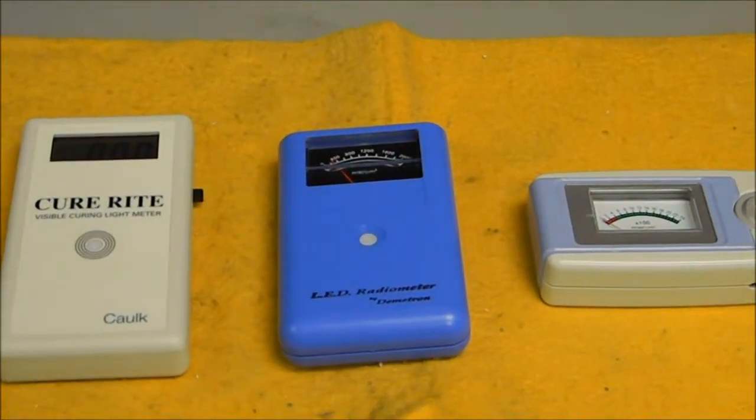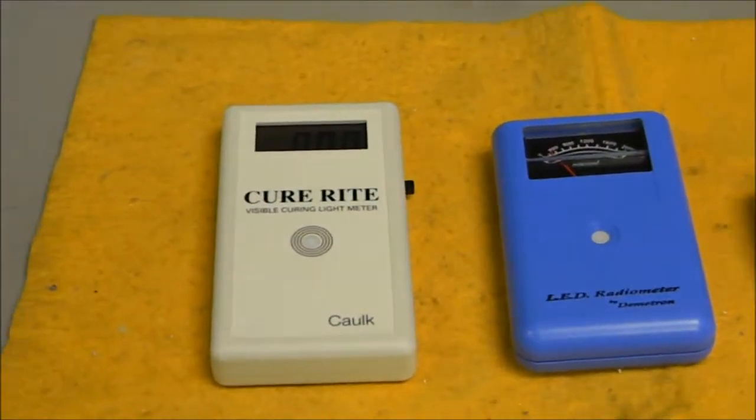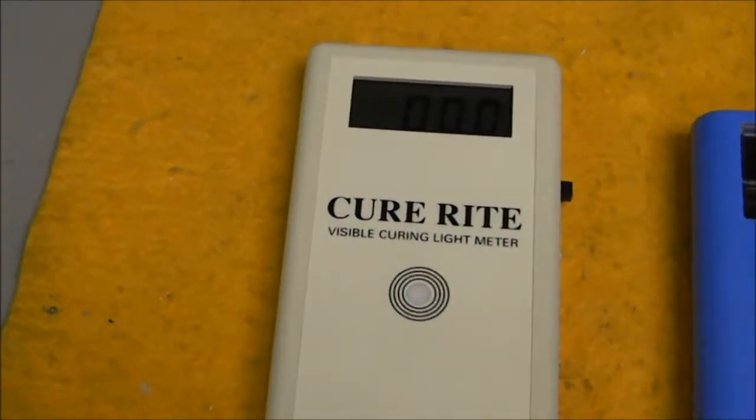Let's take a look at how our three radiometers measure the output of the ARP L5 LED curing light. We'll start with the Curite visible curing light meter from Densply.